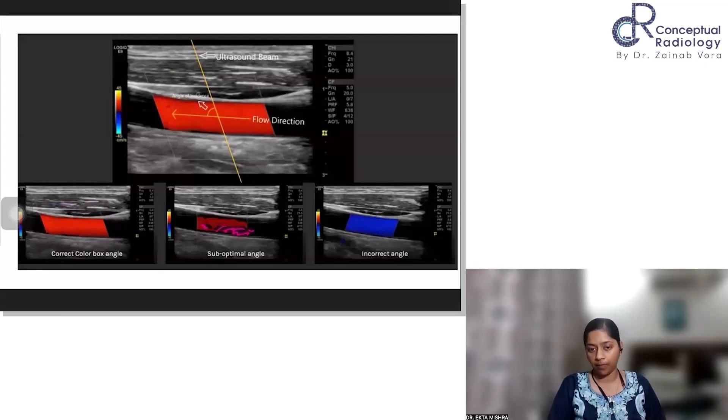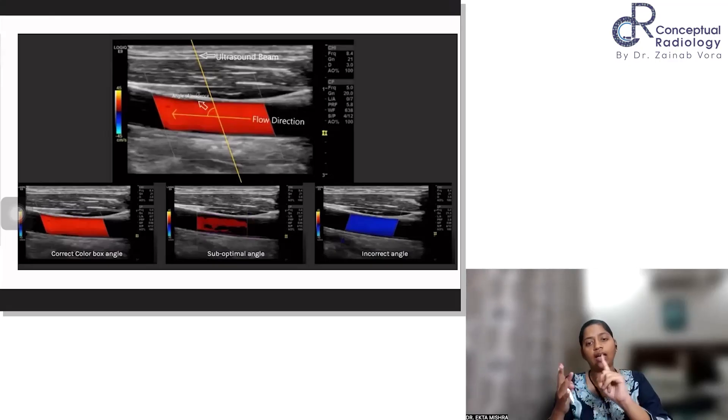If the angle is suboptimal, there is patchy loss of color. So when your color image is not good, the spectral will also be not good. So start optimizing your grayscale first, then the color Doppler imaging and followed by the spectral one. Then we can go for angle correction and everything.